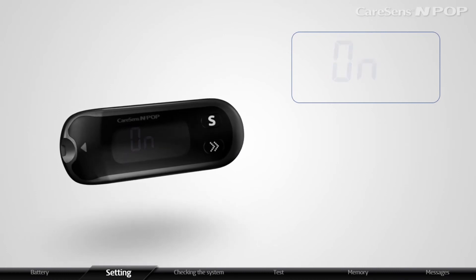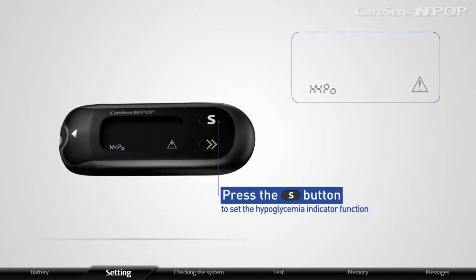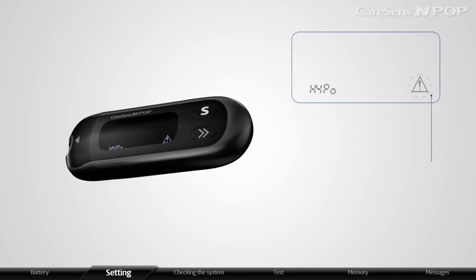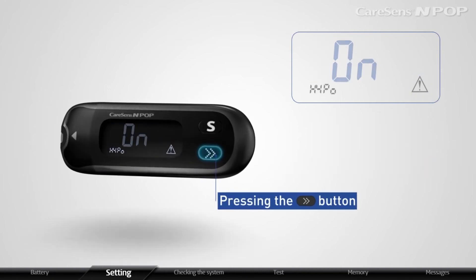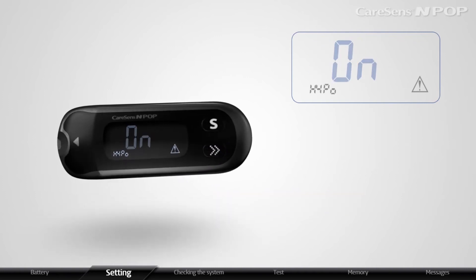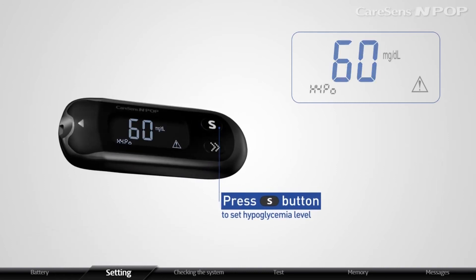After setting the strip expiration date indicator function, press the S button to set the hypoglycemia indicator function. The meter will display hypo and the hypoglycemia icon. The meter displays on or off by pressing the arrow button. When on appears on the display, press the S button to set the hypoglycemia level.